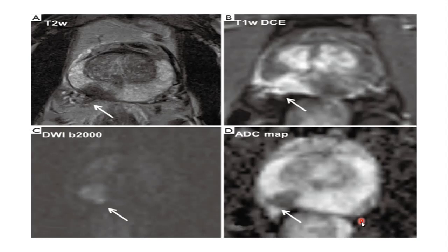Now, in the context of prostate, there are a lot of things available, not only multiparametric MRI, which we think may be the final verdict on prostate imaging. You have mentioned one point in your slide about radionuclide.